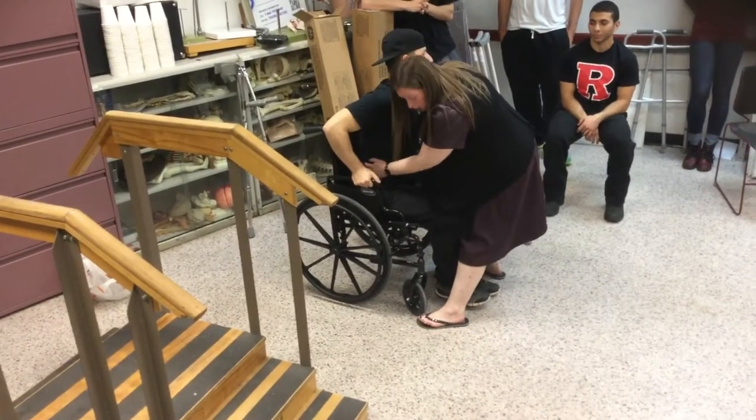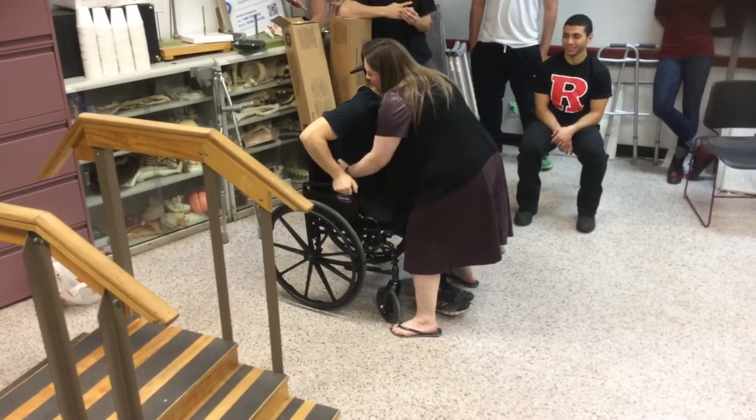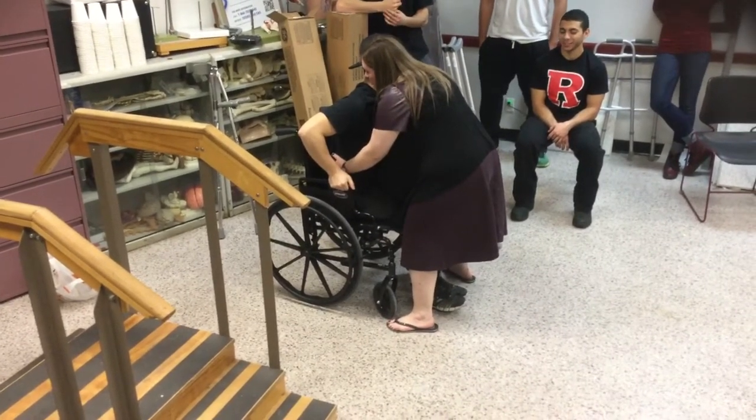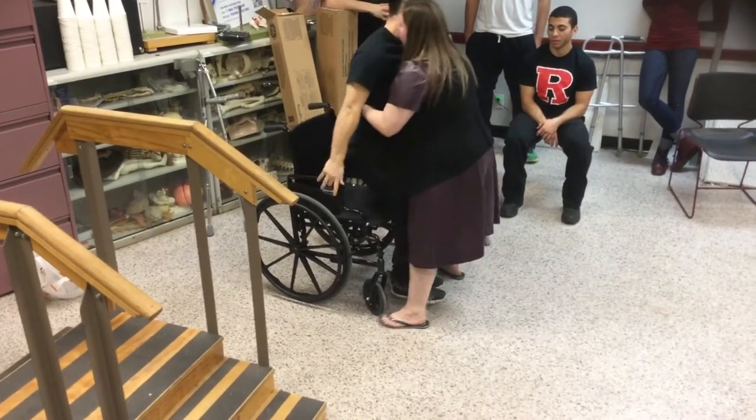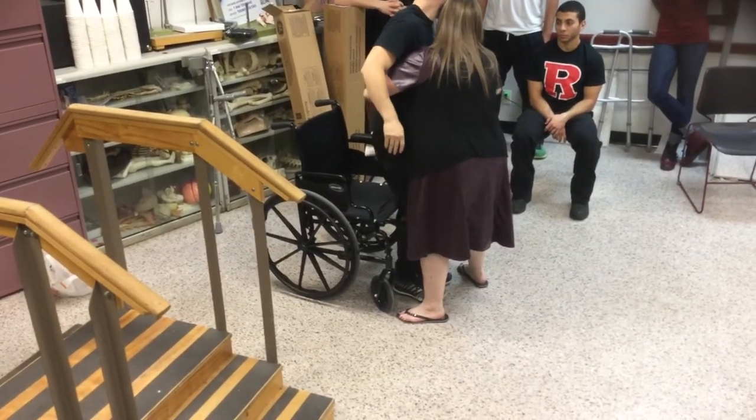Is that leg on the floor? On the count of three, we're going to stand. Remember, keep that leg off the floor. One, two, three — stand up. Now this, you're really on top of that because you have to be.